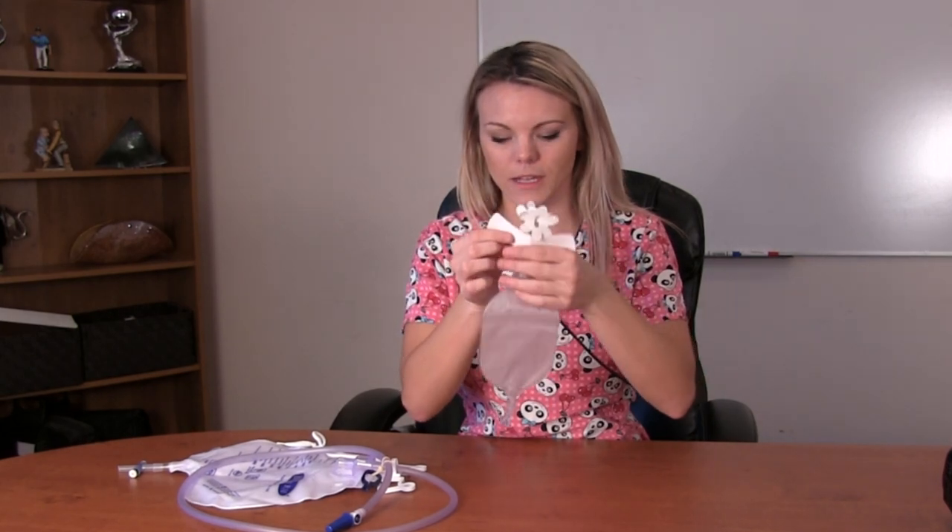Now we're going to do the demonstration of how to connect the night bag with the men's liberty bag. This is a very common question. You'll see you have your men's liberty bag — it looks like a flower with a band underneath it. What you want to do is make sure that when this is attached, the bag is completely empty.